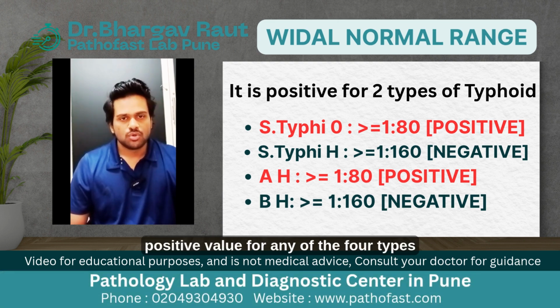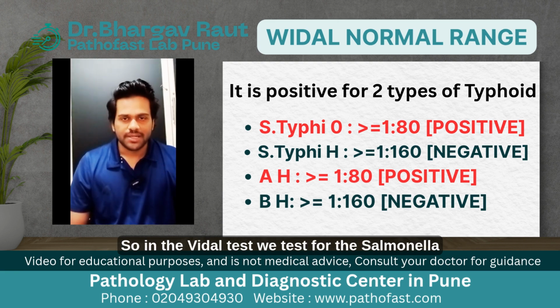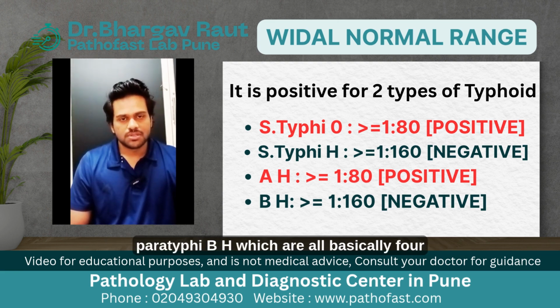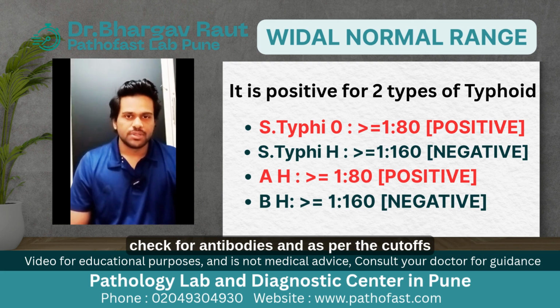Is a titer of 1:80 or 1 divided by 80 considered to be positive or negative in the Widal test? So a cutoff of 1:80 is considered to be positive for the O and the AH types of typhoid antibodies. That means that it is considered positive for paratyphi A as well as for Salmonella typhi, but it is not considered positive for the H antibodies and definitely not for the paratyphi B. And so you have to interpret with caution.